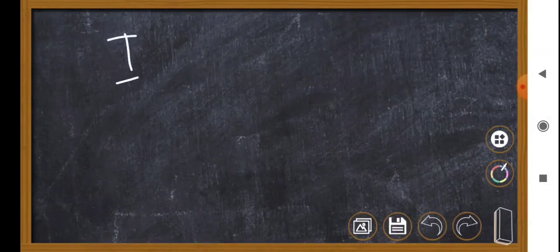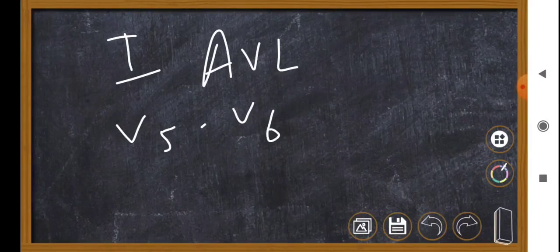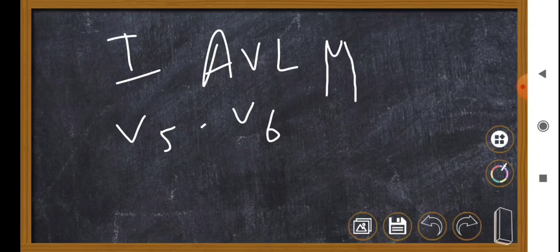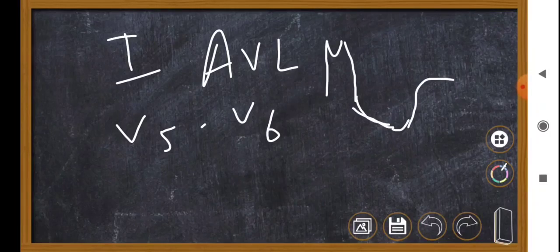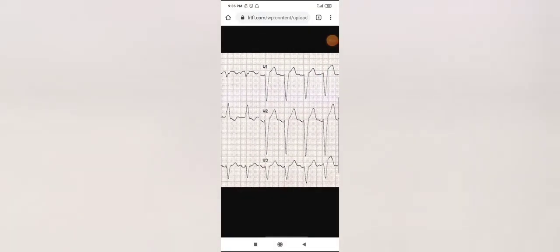In leads I, aVL, V5, and V6, the QRS shows a prominent R wave, and as the ST-T must be discordant, the ST segment is depressed and the T wave is inverted. So the complex in these lateral leads shows a tall R wave followed by ST depression and T wave inversion. These are salient features of left bundle branch block.